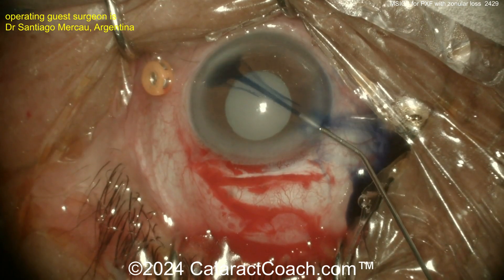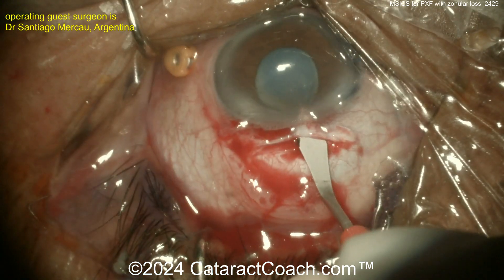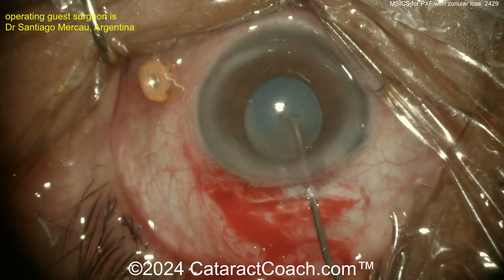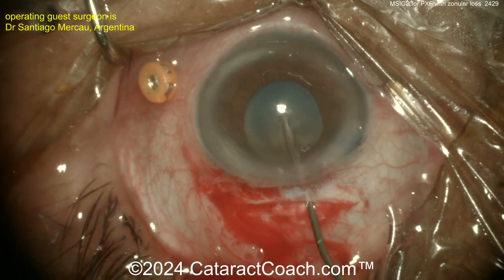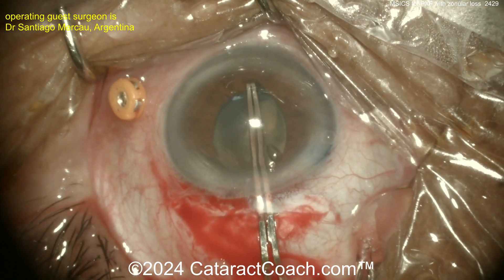On this case, be careful with the trypan blue dye — because of the zonulopathy, you may get it into the vitreous cavity. Here making an incision, you can see that long incision — that's a scleral tunnel being made in the MSICS manner. As you start the rhexis, look, there's motion or mobility of the entire nucleus.